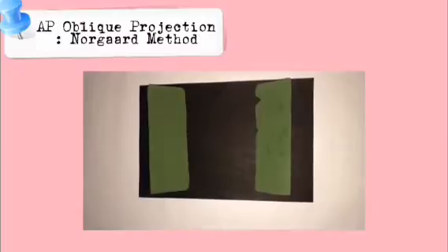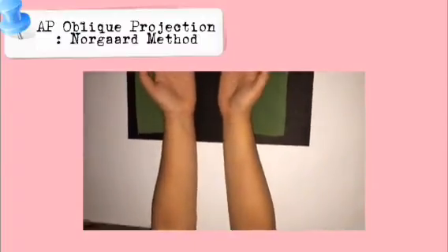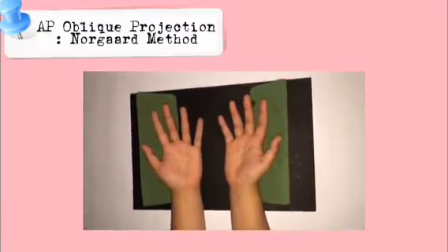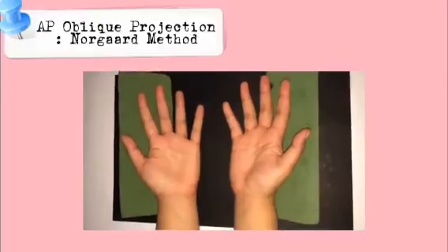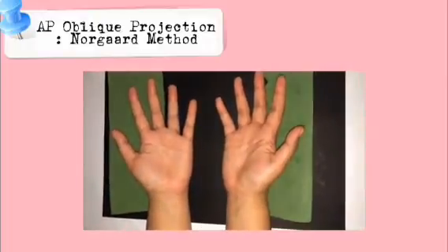AP oblique projection, Norgard method. Position of patient. Sit the patient at the end of the radiographic table. Norgard recommended that both hands be radiographed in the half supinate position for comparison.